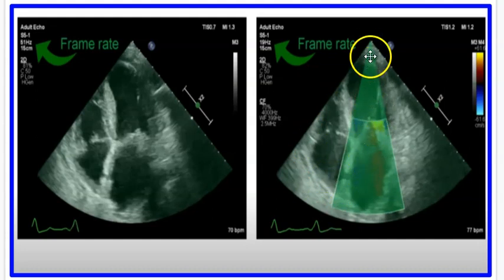Put our color box on, the transducer has to create a box not just this big, but this big. So it's doing two things at the same time. Therefore, it's going to decrease the frame rate, the rate at which the machine can display that image, and that's going to drop down substantially. So we want to keep that, like I said, 18 or above. In this case here, it's 19 hertz, and that's fine.